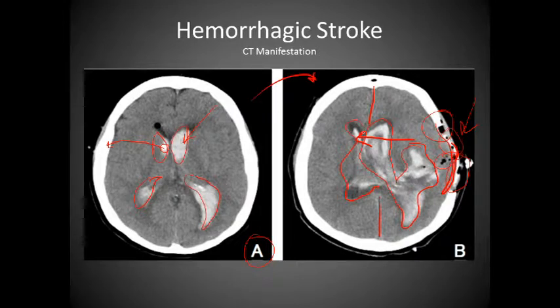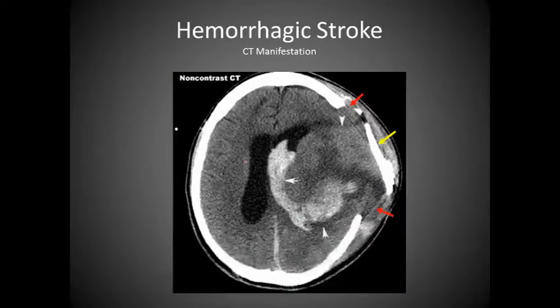stroke. We don't really have an idea of what caused this. Based on the patient size and the brain type, it looks like this might be a very young patient, simply because of looking at it. Interestingly enough, the patient's skull diameter in this direction is close to skull diameter in this. So that could suggest abnormalities of the skull as well, or impeding growth.